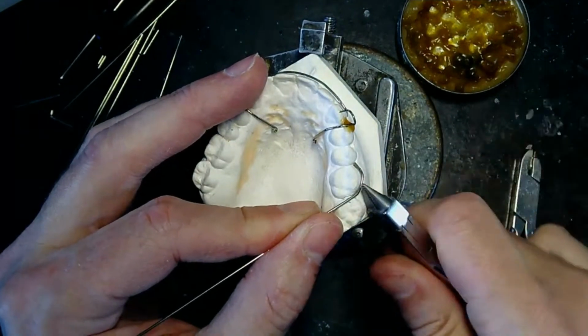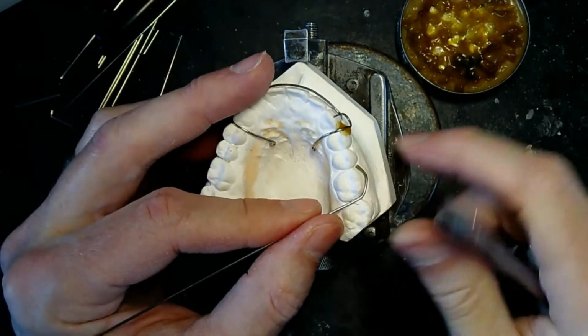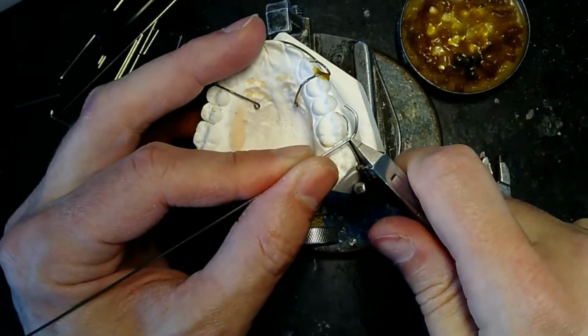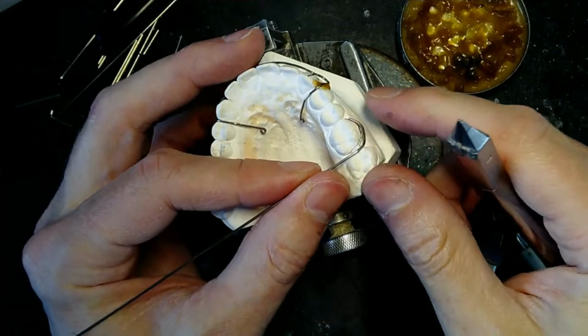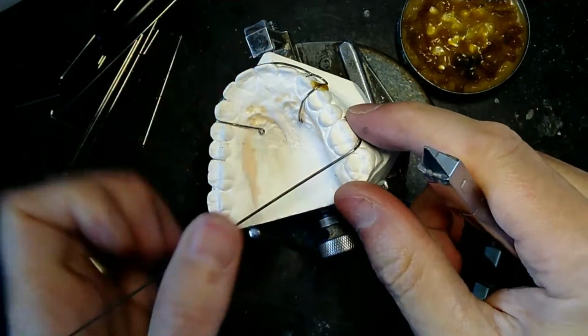So then I'm gonna take my C-clasp and then mark it where it's touching the tooth last in the occlusion. And then I'm gonna bend it down and a little bit in, just a little bit. Or mesial, I guess, if I need to use the right terminology.